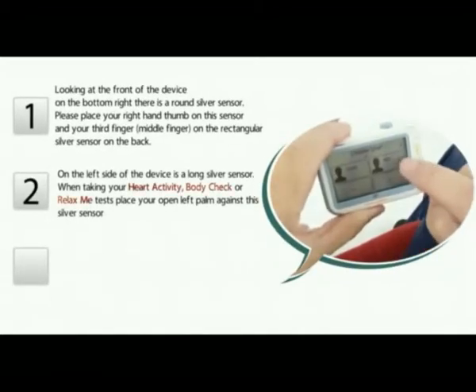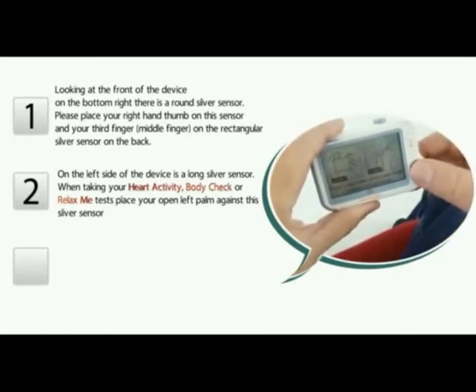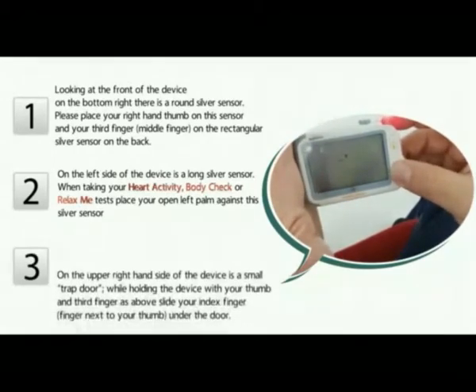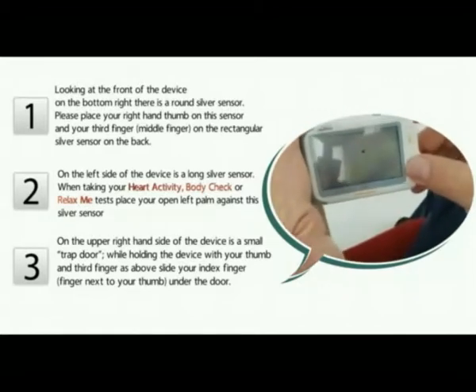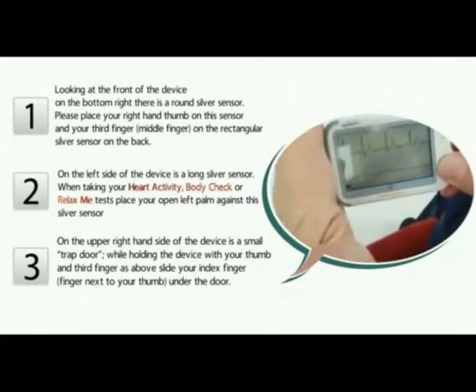On the left side of the device is a long silver sensor. When taking your heart activity, body check, or relax me test, place your open left palm against this silver sensor. On the upper right hand side of the device is a small trap door. While holding the device with your thumb and third finger as above, slide your index finger — the finger next to your thumb — under the door.